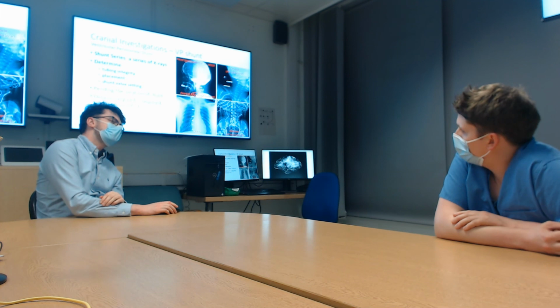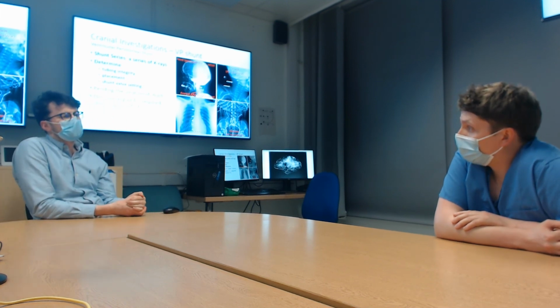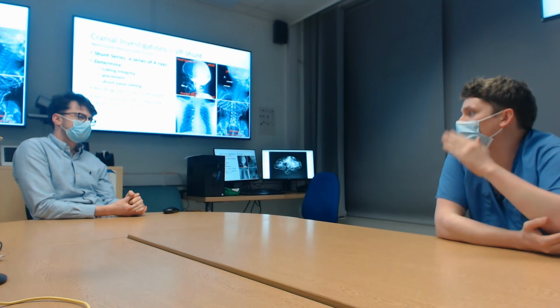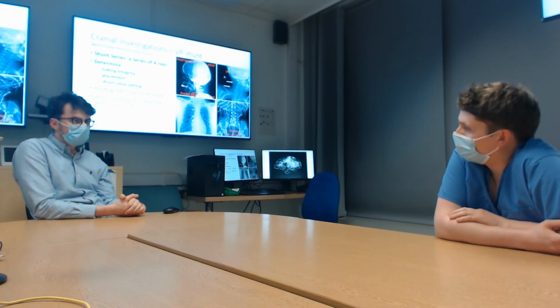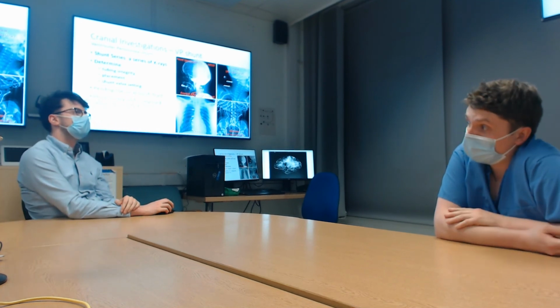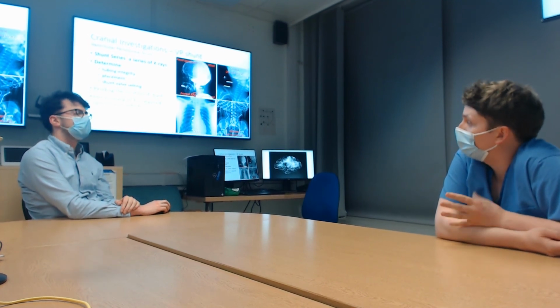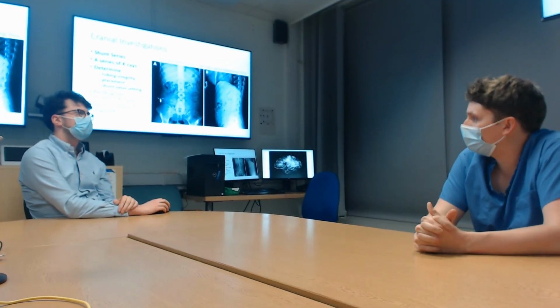Would you ever get a CT scan to assess a shunt position? You can do, yeah. Sometimes it can be pretty difficult if the abdominal end is very superficial, and it can still be intraperitoneal, but you can't be 100% sure on the X-ray. Or you can have a pseudocyst around the tip of the shunt in the abdomen, and therefore it's not fully draining, and only really a CT or sometimes an ultrasound, depending on its location, will tell you.